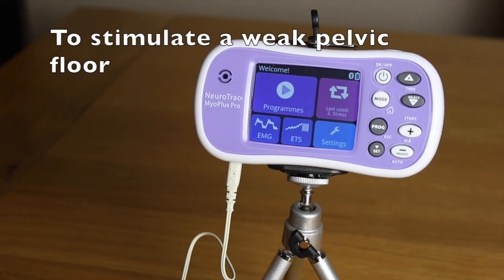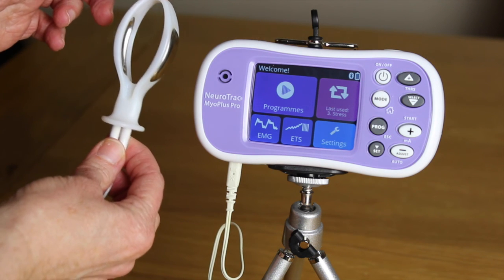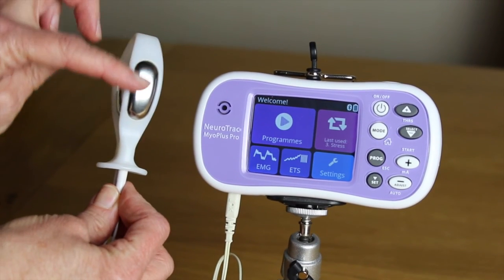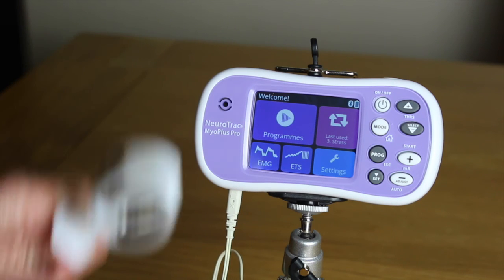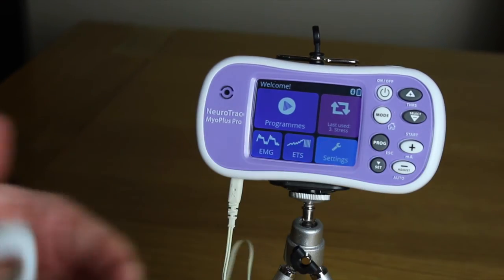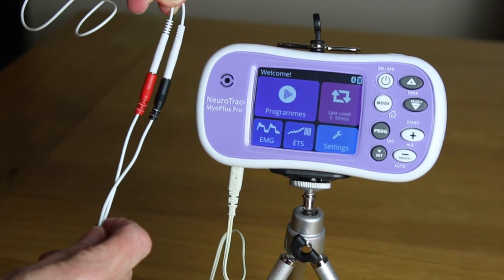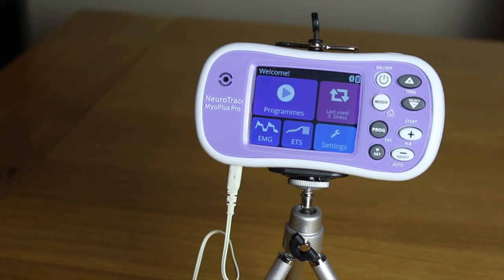Let's have a look at the MyoPlus Pro's main functions. To stimulate a weak pelvic floor we use the periform electrode vaginal device. Once inserted into the vagina, the sensor plates sit alongside the muscle and deliver the stimulation. I'll use surface electrodes to demonstrate the effect. Always ensure that there is a good connection between the cables and no metal is exposed.